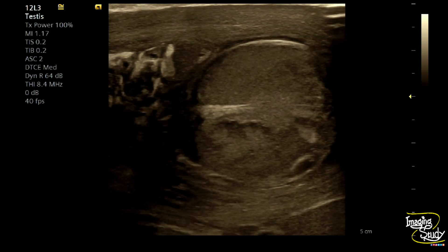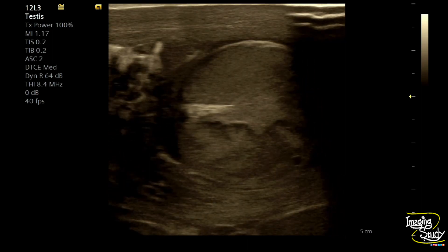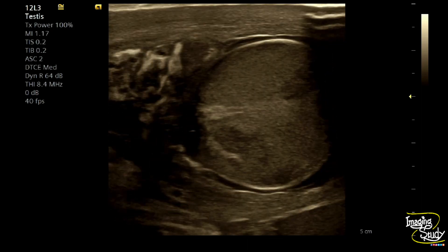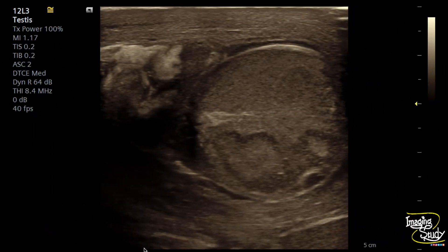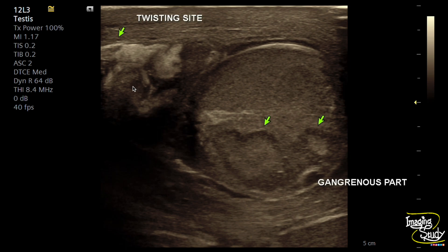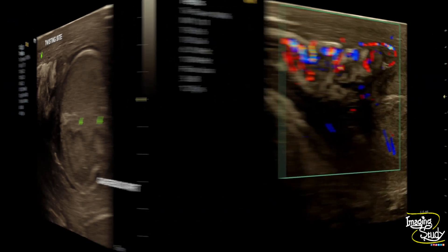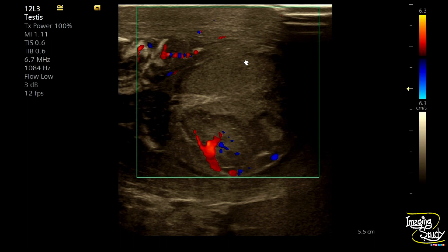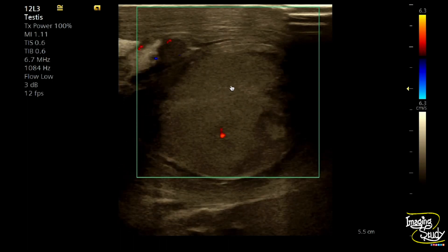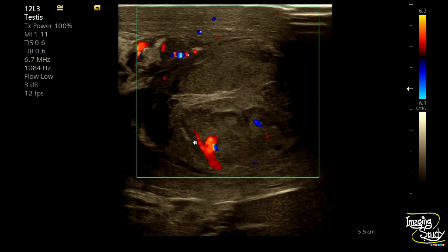These necrotic zones are features of the sub-acute variety of testicular torsion. We need to use color Doppler to exclude necrosis and to detect the stage of torsion. Here you can see the necrosed areas within the swollen hypoechoic left testis and mild peritesticular collection. The area of necrosis at the upper part shows a laminated echogenic mass which might be the area of twisting.